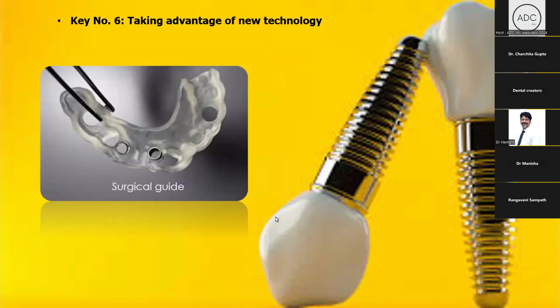Now, after CBCT, second is the surgical guide. So a surgical guide may be fully guided or partially guided. Fully guided means when we make a guide or a lab makes a guide, we just have to drill along the holes they have given.